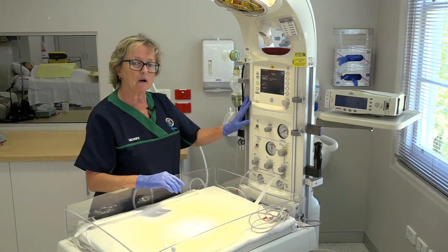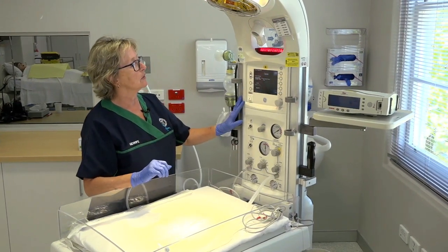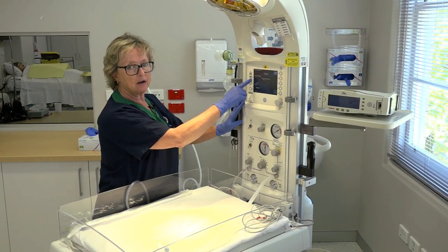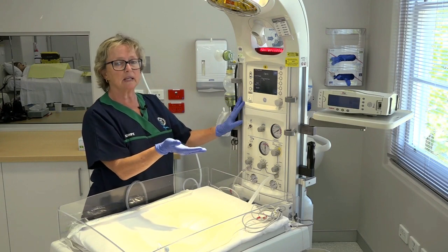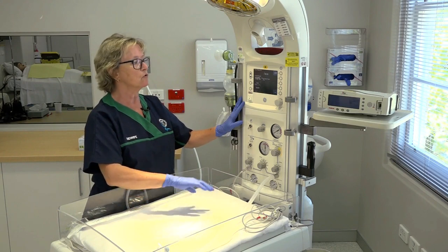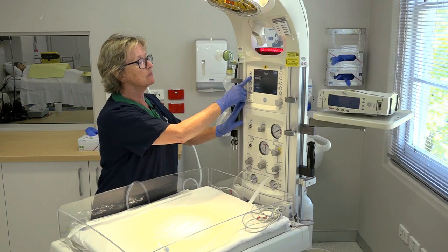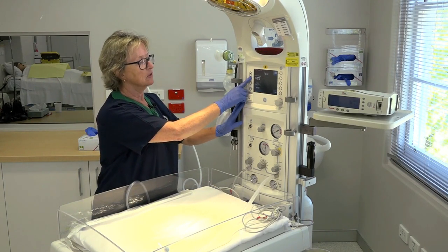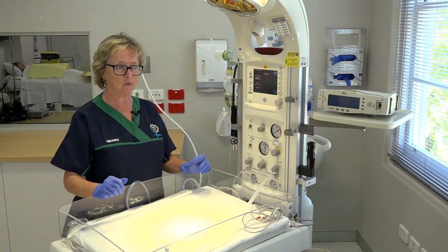By turning on the Apgar clock, you can see the display here on the screen. It immediately turns the heater output to 100%. Now this warmer gets very, very warm and it can be too warm for the baby, so use your judgement — maybe after about five minutes have someone turn the heater output down, because otherwise the baby will overheat, and that's equally a problem.